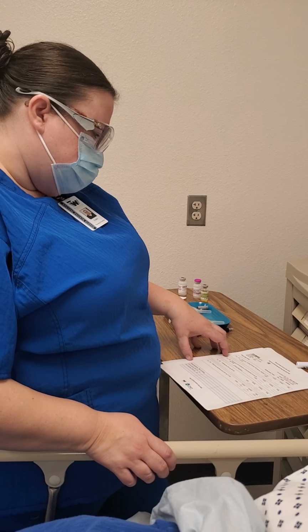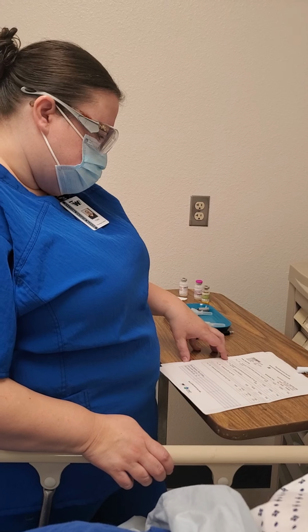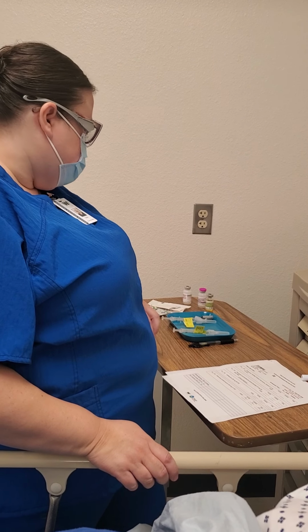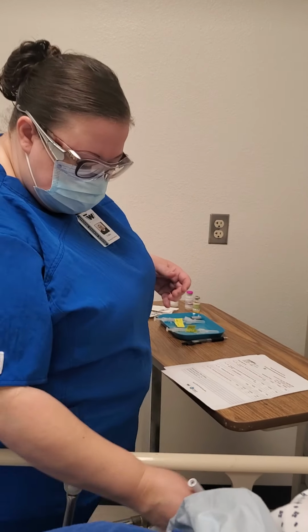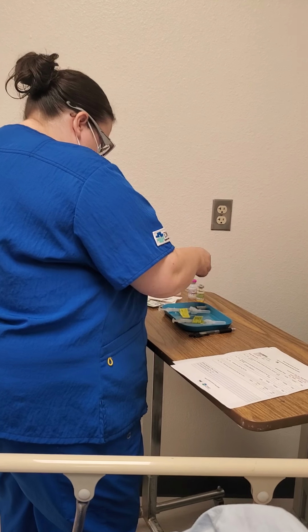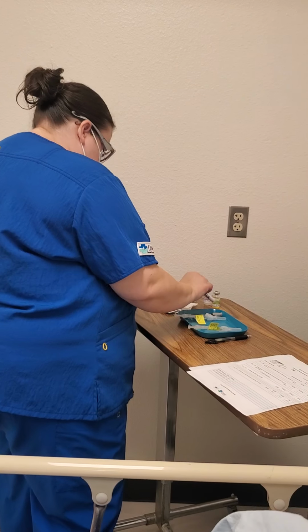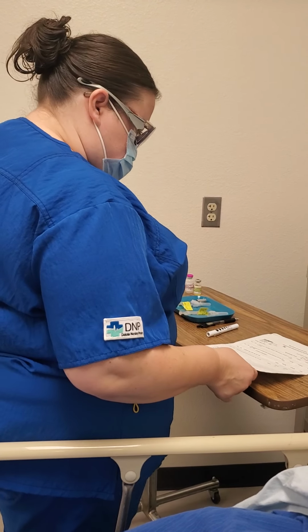It's a purified protein derivative, and it's diluted 0.1 milliliters, and that's just a one-time thing. Okay, so I'm going to scan your bracelet here, and then I'm going to scan the meds. Okay, and everything came up here fine with that.